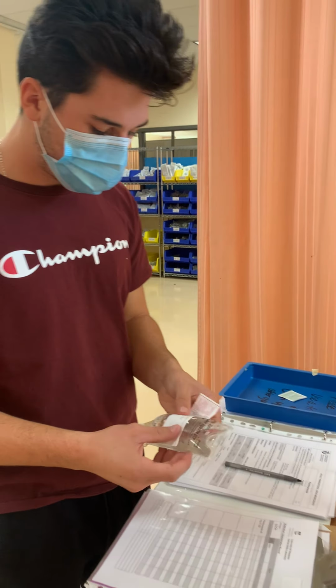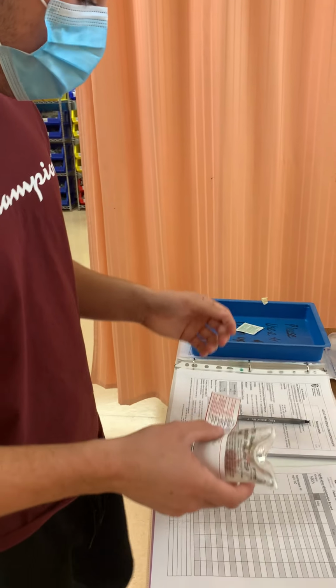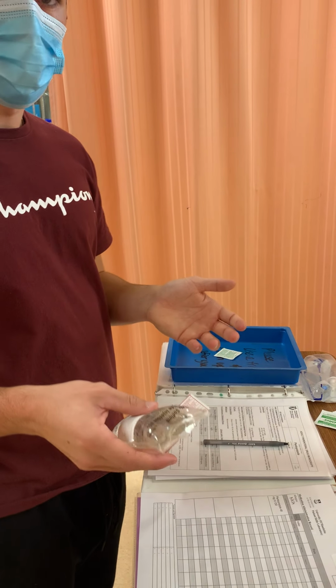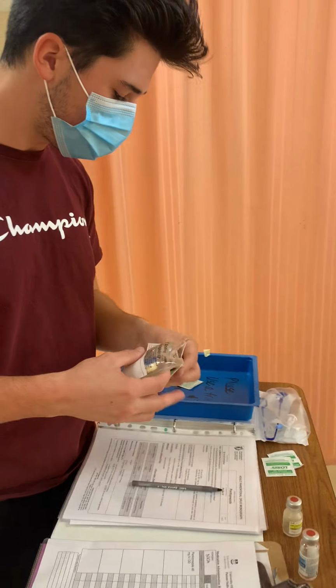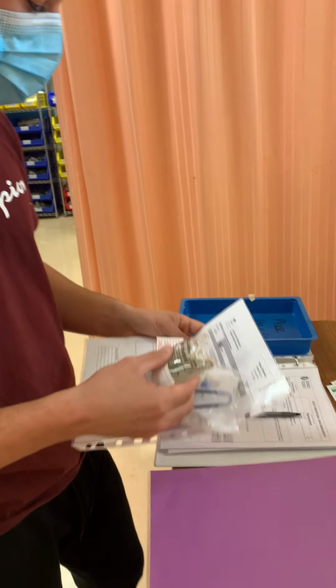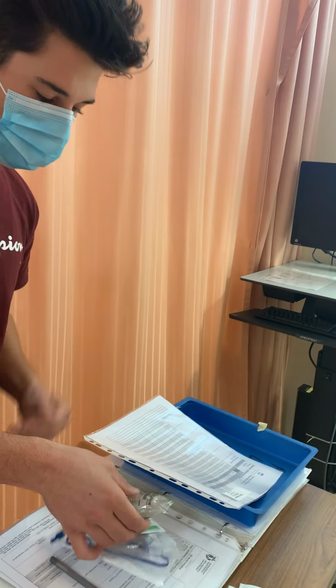So once I've written my label for my medication and I've checked it with my MAR and everything matches, I can go ahead and head to my bedside. So I'm going to grab all the equipment that I'm going to need for my bedside, my alcohol swab, my secondary tubing, my MAR, and then I can go ahead and go to the bedside. So I'm going to enter into the bedside. Oops, you want to drop that? So I have all my equipment.